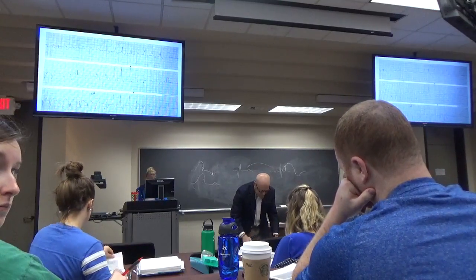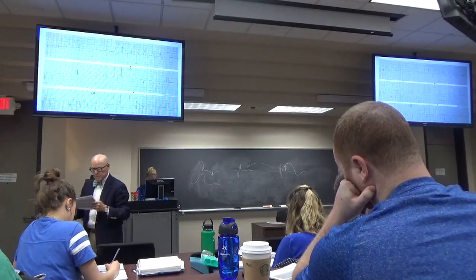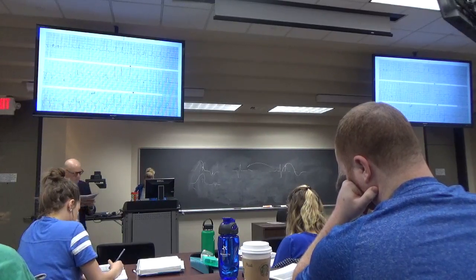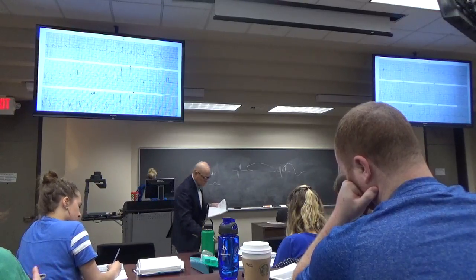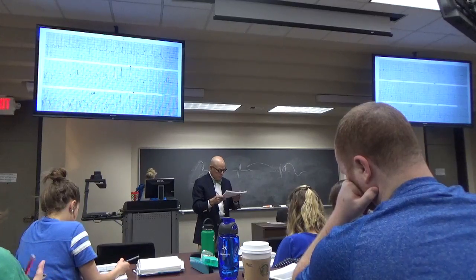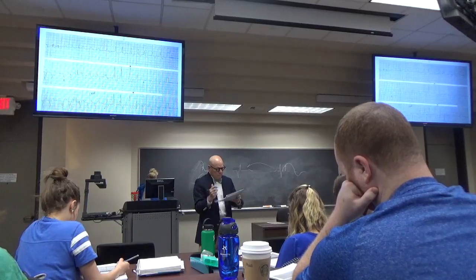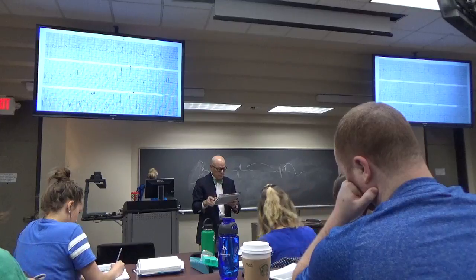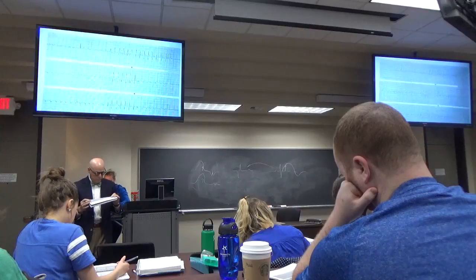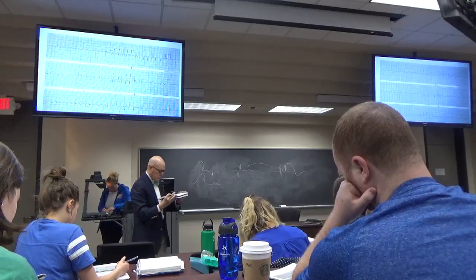Yep. Okay, so I got sinus tachycardia, heart rate 180, PR is 0.04, QRS 0.12, QT 0.28, negative 70 for the axis, LAD. Got pre-excitation syndrome, atrial flutter, anterior septal primary T wave changes, anterior age indeterminate, and septal old MI.